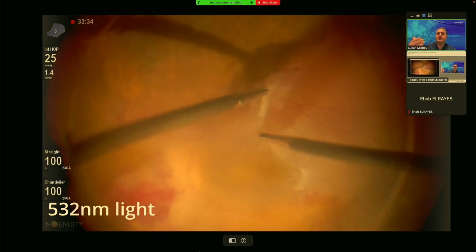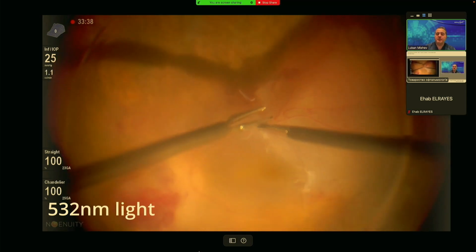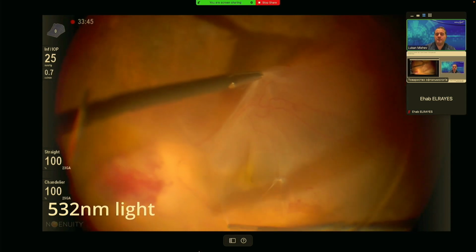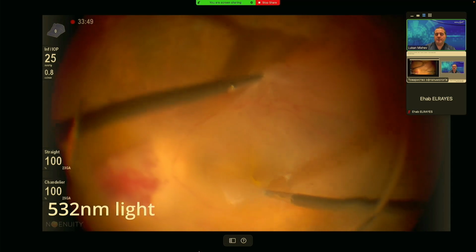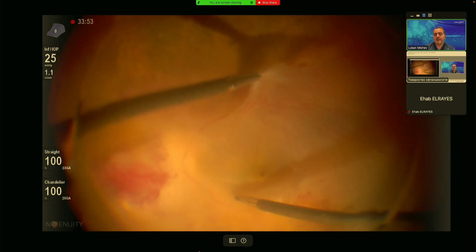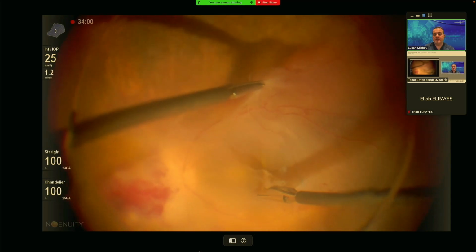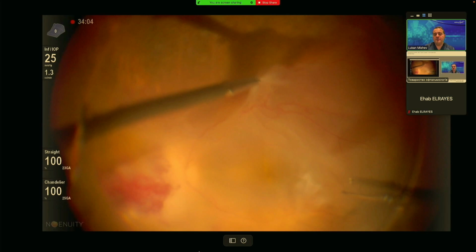illumination, we might extract more information from the surgical field at this part of the procedure. You can see the membrane here, which I try to gently remove because sometimes we might induce or enlarge existing macular holes. But anyways, if we see better, I do believe that we do the surgery better.